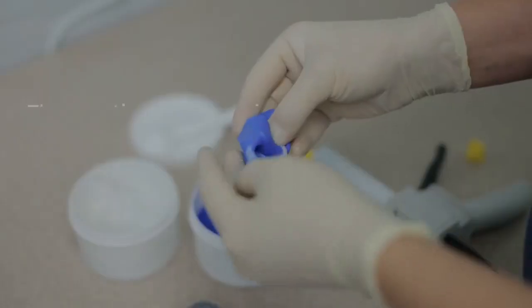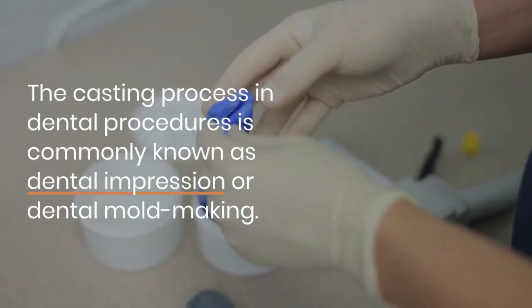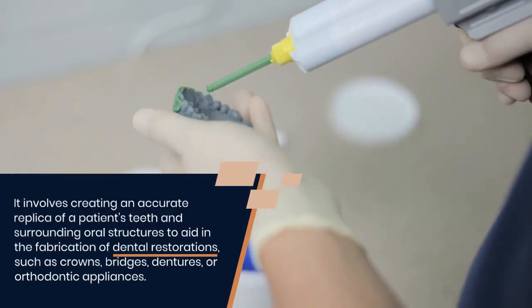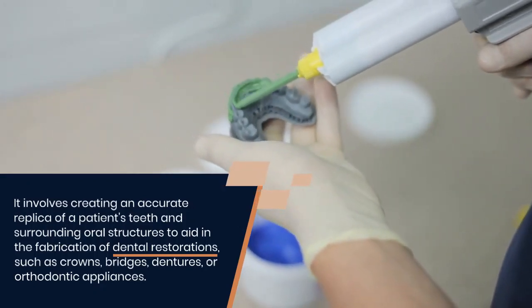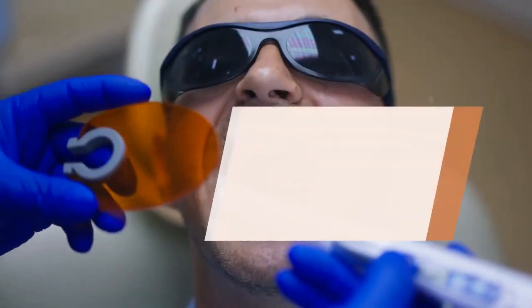The casting process in dental procedures is commonly known as dental impression or dental mold making. It involves creating an accurate replica of a patient's teeth and surrounding oral structures to aid in the fabrication of dental restorations, such as crowns, bridges, dentures, or orthodontic appliances. Here's an overview of the casting process in dental procedures.